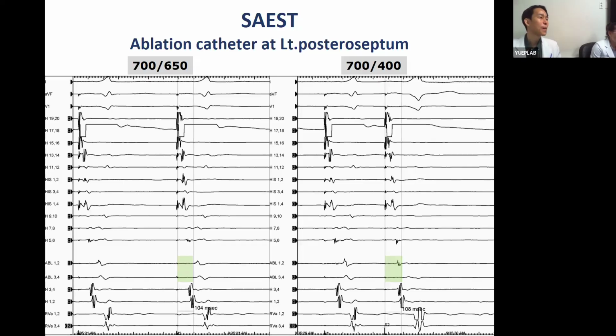Okay. There is, I think, a certain misunderstanding about people measuring conduction properties based on the stimulus. No, that's wrong, because the stim-to-capture interval can be longer than the actual decrement. So you need to measure the EGM-to-EGM conduction, not the stimulus. Simply, the stimulus is easier to see, so people measure that. That's a big mistake. Don't do it, especially in pacemaker implantation. You can have a first-degree exit block for the stimulus, Wenckebach block, 2-to-1 block, all these things. So the measurements where you're drawing the line there are not right.